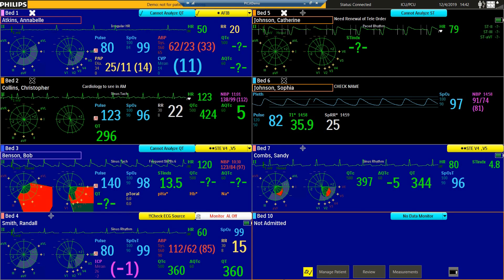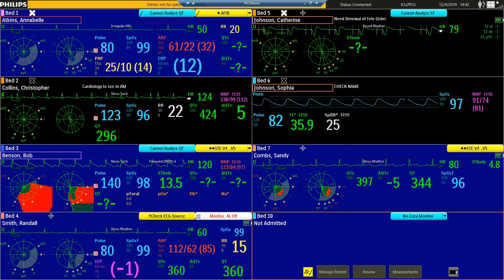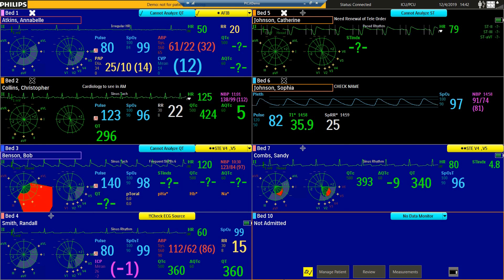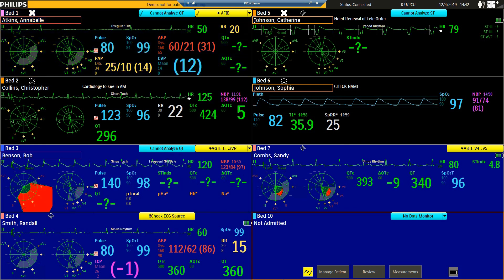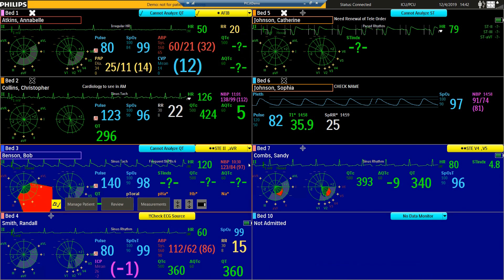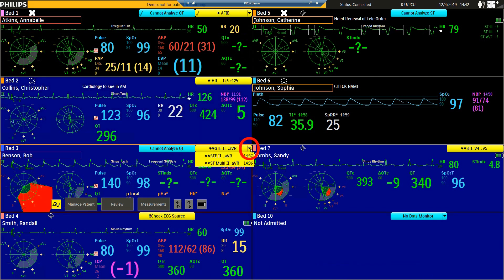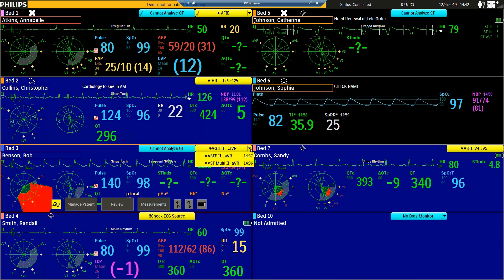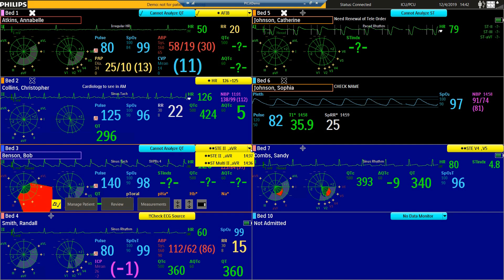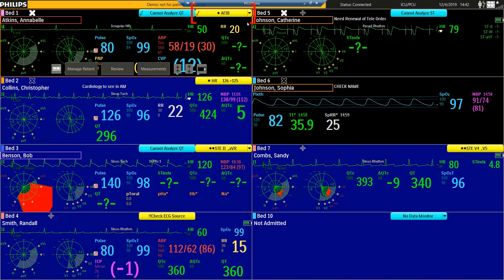When a patient is reporting with multiple alarms, the PIC-IX displays and enunciates the most severe alarm first. This arrow indicates the presence of additional alarm messages. Notice the alarm message includes a timestamp for each of the alarms.